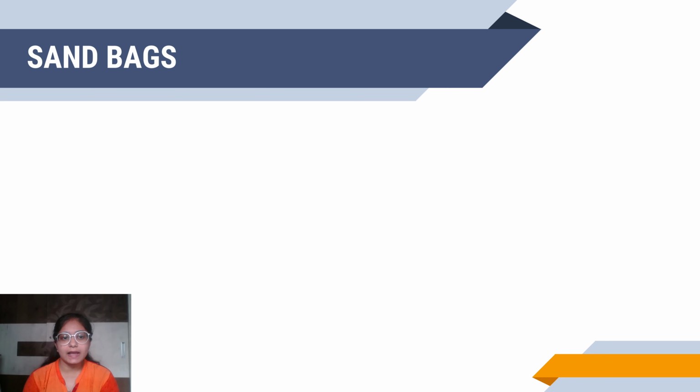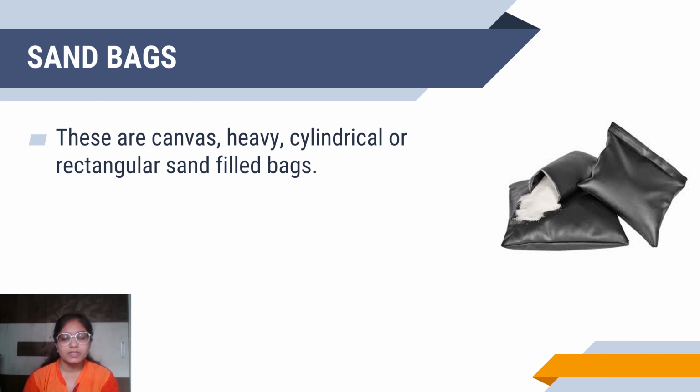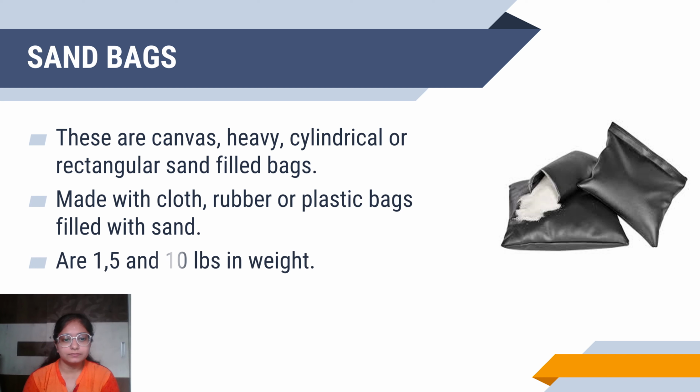Another is sandbags. This is the picture of sandbags. Sandbags are canvas, heavy, cylindrical or rectangular bags filled with sand inside. Sandbags are made with cloth, rubber or plastic bags filled with sand. They are 1, 5 and 10 pounds in weight.